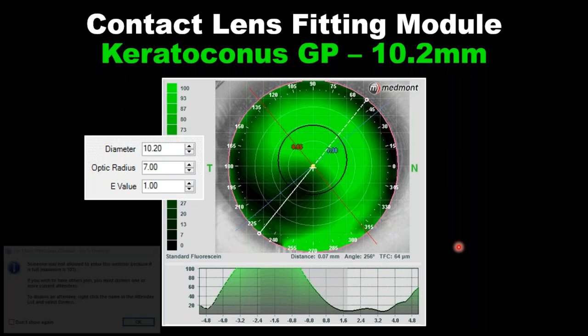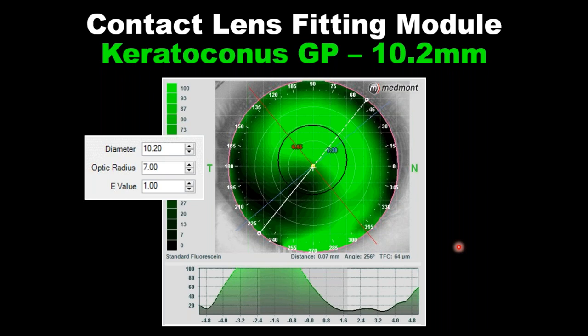Now let's use the topographer to fit a contact lens — we've placed a rigid contact lens on the eye in a simulated environment. Ahora vamos a usar el módulo de adaptación de lentes de contacto. Lo que hicimos fue poner un lente de diámetro 10.20mm encima de una córnea para que el módulo nos ayude a adaptar ese lente de contacto. I'm going to steepen the base curve until I have a lens that clears the apex of the eye and protects the diseased tissue.